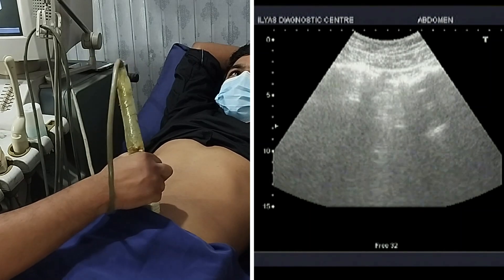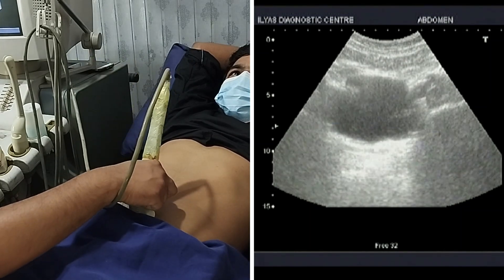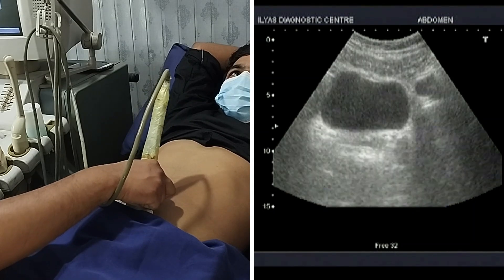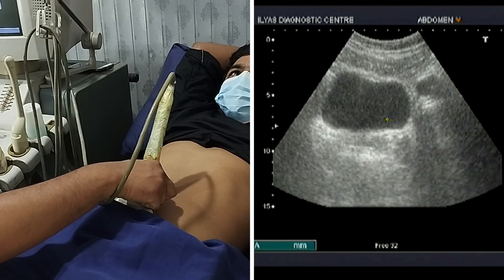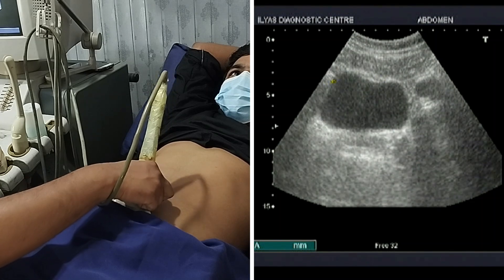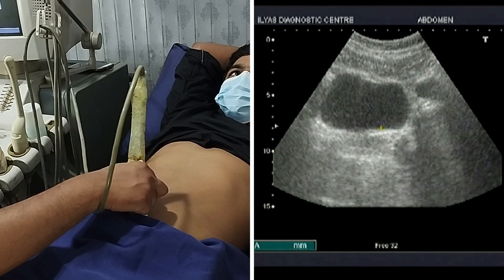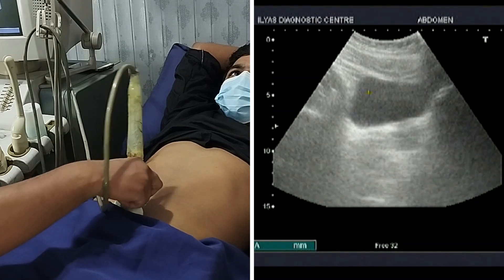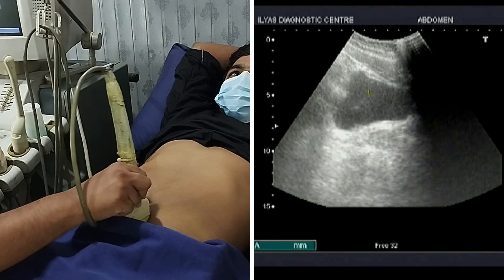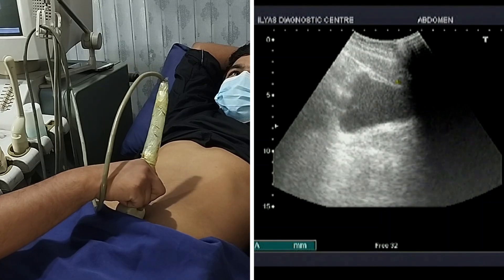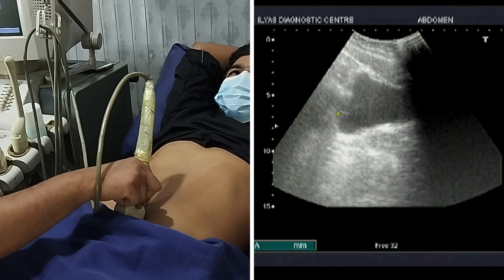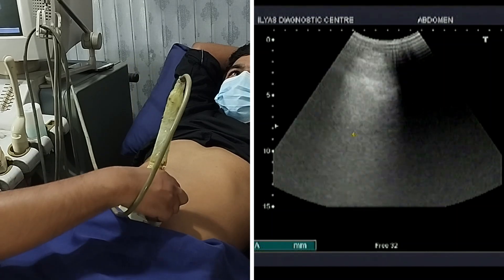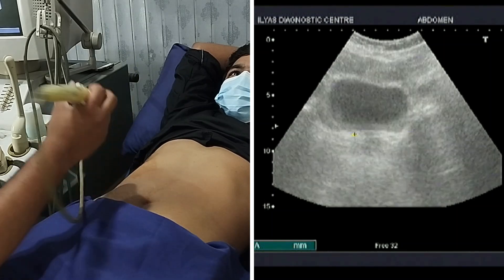Next, put your probe in the suprapubic region. I will tilt it downward and here I can evaluate the urinary bladder — the urinary bladder is completely visible. Now I will move my probe in the vertical direction and the entire urinary bladder is visible.